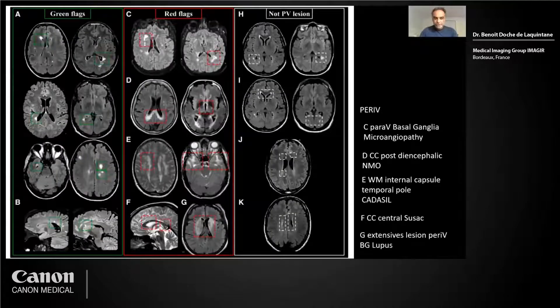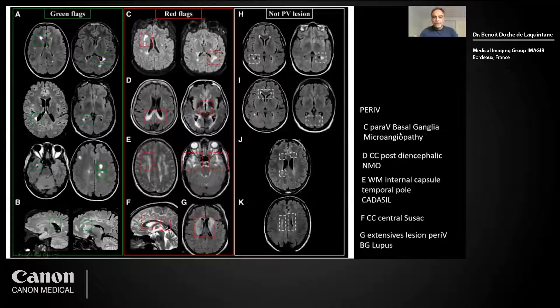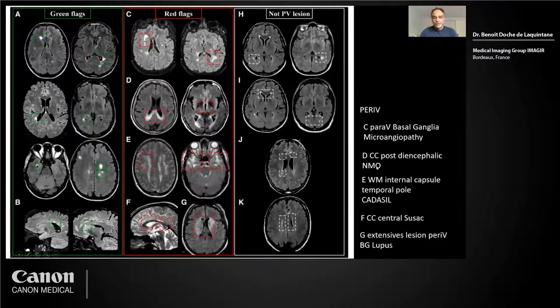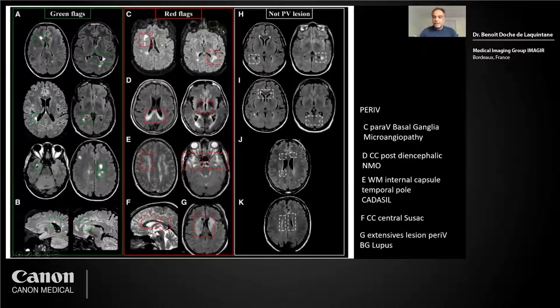Green flags include periventricular lesions, while red flags indicate other diagnoses. For example, paraventricular and basal ganglia lesions suggest microangiopathy. A posterior diencephalic distribution is more in favor of neuromyelitis optica, probably aquaporin-4 positive. A lesion central on the corpus callosum is more in favor of SUSAC syndrome. A lesion on the temporal pole is in favor of CADASIL.